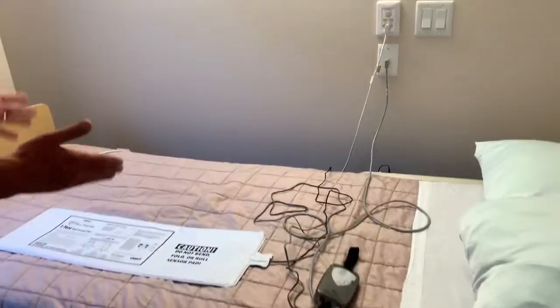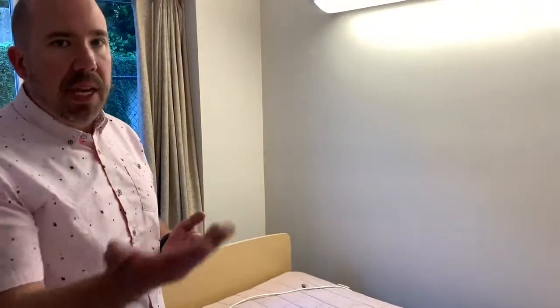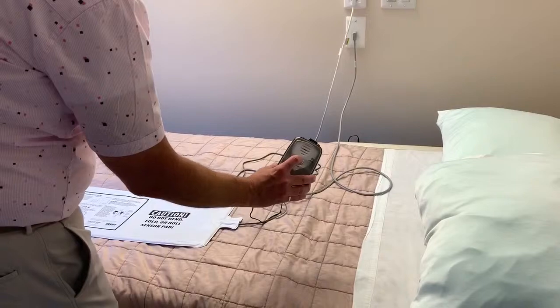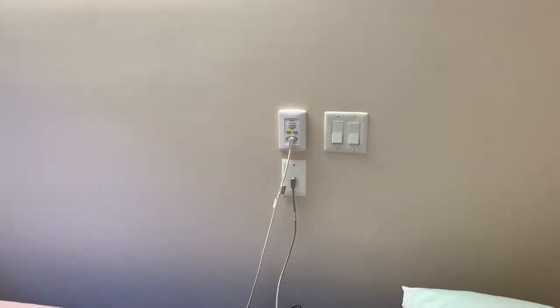So you'll just place the resident back in bed, or let's say we just want to reset it, because let's say they were getting up in anticipation of lunch. You're just going to come to this device. You're going to hit the reset button here one time, the light stops blinking there, and the light stops blinking there, showing you that the call is completely cleared.